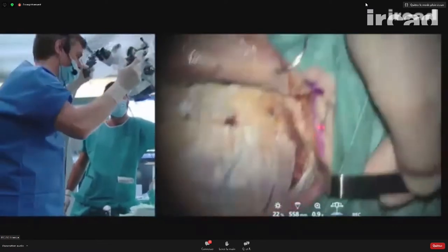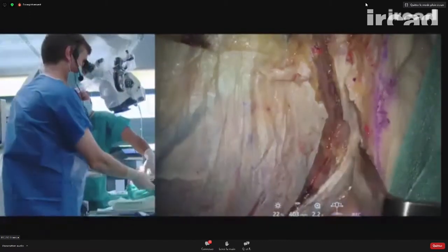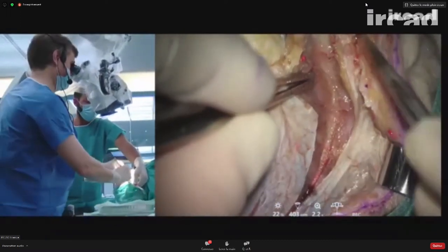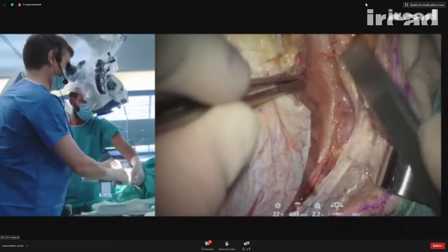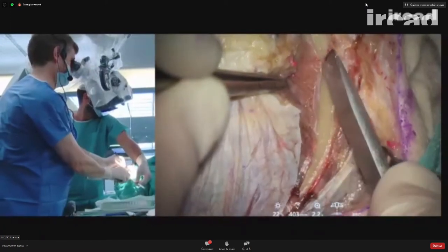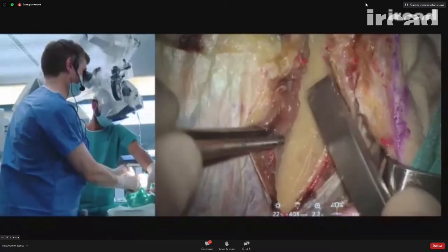Now, most important is to start the retrograde dissection of the temporalis muscle. So for this, you need to identify here the periosteum and cut the periosteum. And then with a sharp instrument like this, progressively you elevate the periosteum from inferior to superior. You want to keep this white layer of tissue here intact.